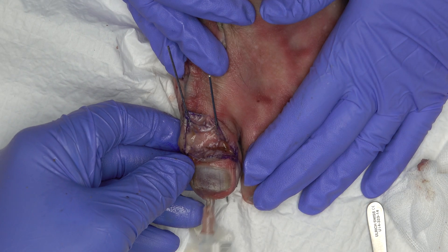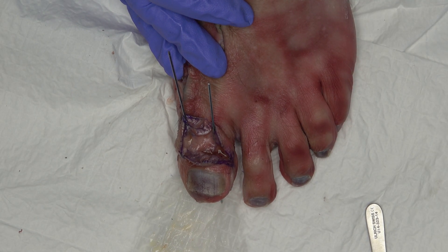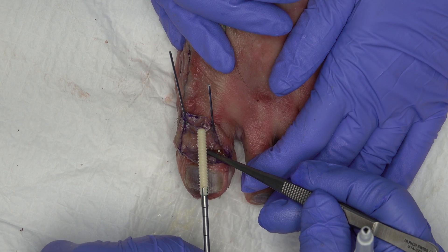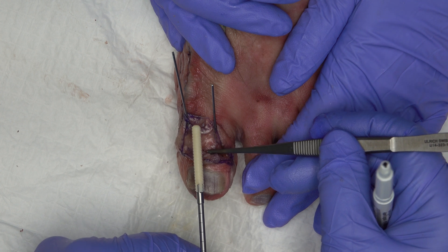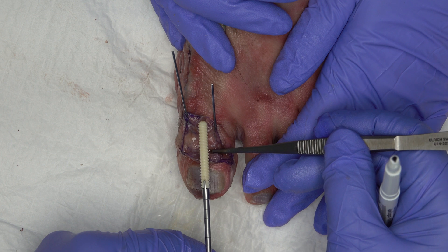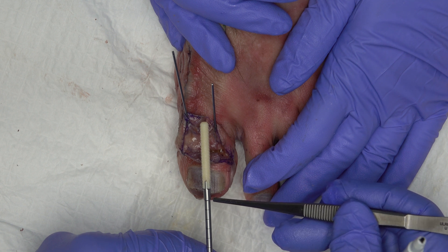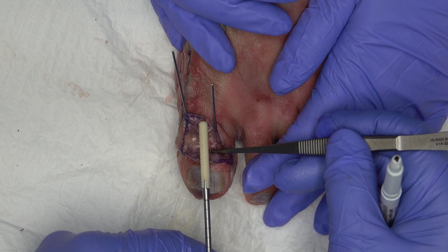After thread cutting, the thread is carefully rinsed. Check with the help of an intraoperative x-ray whether the thread depth is sufficient to subsequently place Shark Screw Diver about 15 mm deeper over the osteotomy gap. The depth to which the Shark Screw Diver is to be inserted can be read off from the laser marking on the tap. The Shark Screw Diver is placed on the special screwdriver. Before screwing in, consider how deep you need to screw in Shark Screw Diver.